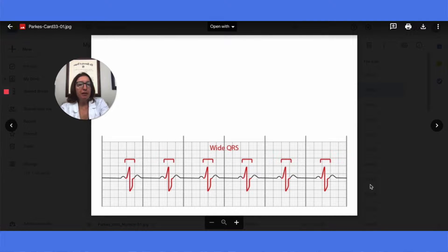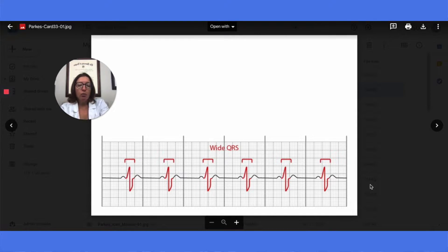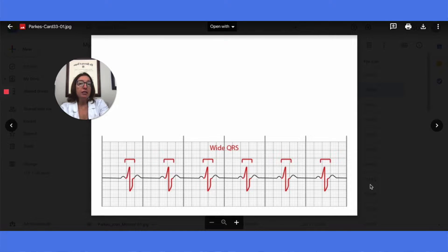One EKG abnormality to be familiar with is something called a bundle branch block, or BBB. With a bundle branch block, the electrical impulse is delayed in the bundle of His or within the bundle branches. This results in a very wide QRS complex — over three small boxes in duration, or over 0.12 seconds in duration.